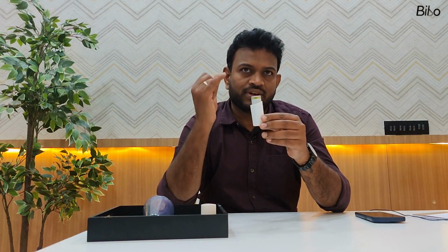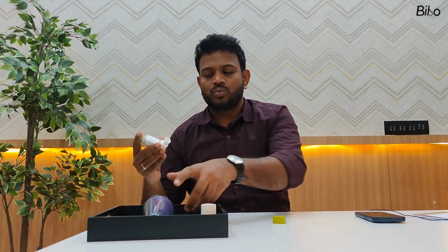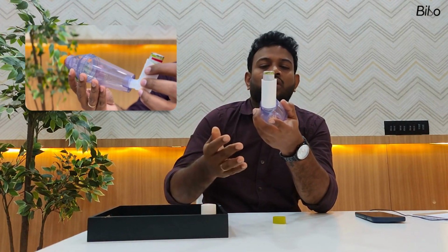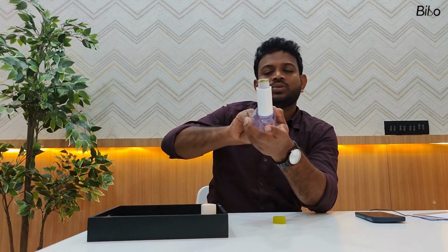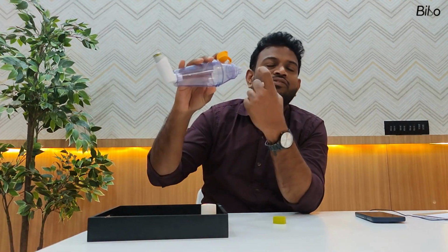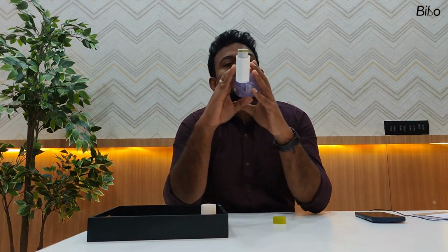As I have told, first we have to warm the canister, then we have to shake this, then we have to remove the cap, and then one end goes on this, lock it. The second end, we have to remove this thing. So this thing goes into the mouth. We have to bite it with our teeth and then again form a tight seal with our lips.